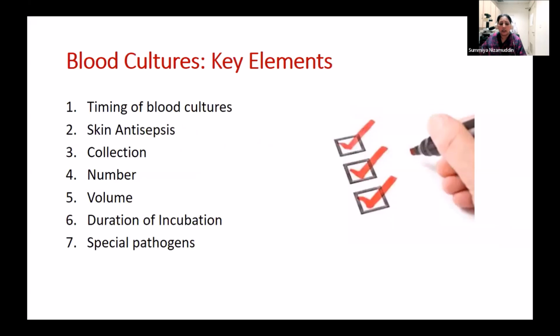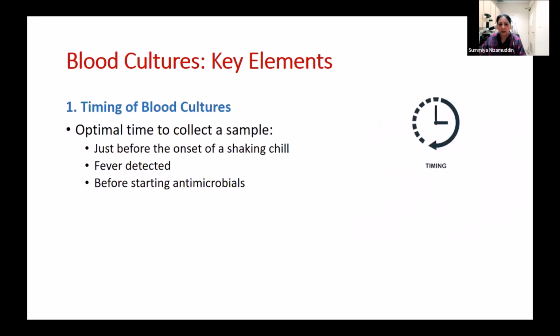So when collecting blood culture, it is very important that you know the timing of blood culture, when to take it, how to do the skin disinfection, how much blood to collect, when to collect it, in how many bottles, how long you are going to ask the lab to hold the bottles for incubation, and whether there are any special pathogens that you are looking for. So I'm just going to discuss that in the next couple of slides.